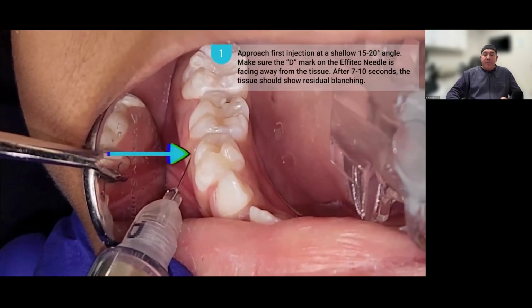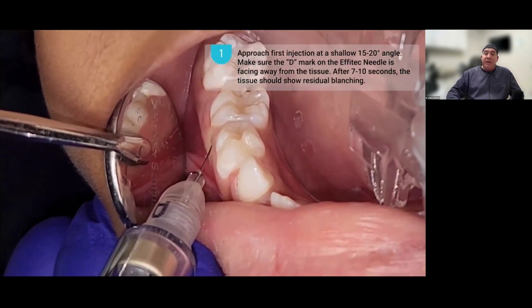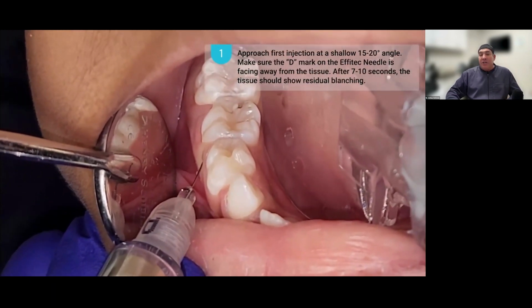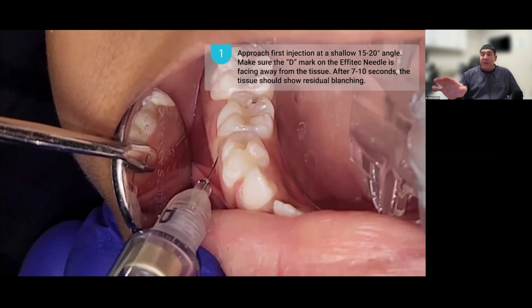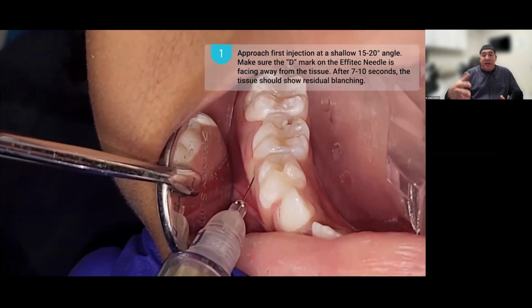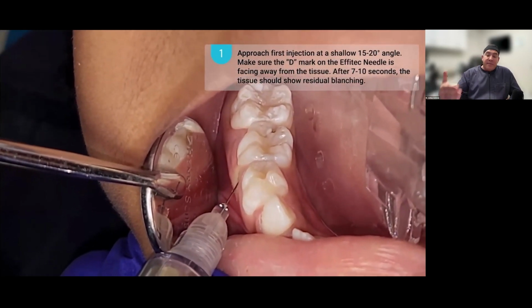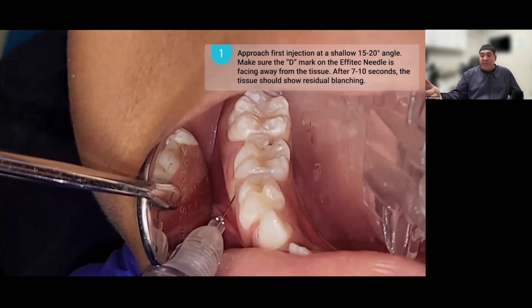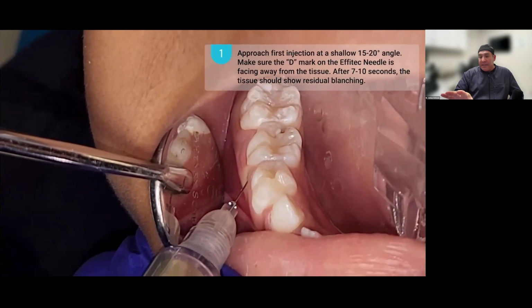So if you pull the needle out right away, you are likely to have some fluid come out there, some local, and the patient can taste that. If you notice, his isolite is in place. So if you're using an isolite, I do encourage you to put that isolite in first. Not everybody does that because you're used to giving, maybe having a standard mouth prop, giving local, and then going to your isolite. But isolite's a great way of making sure that they don't have any bad tastes.